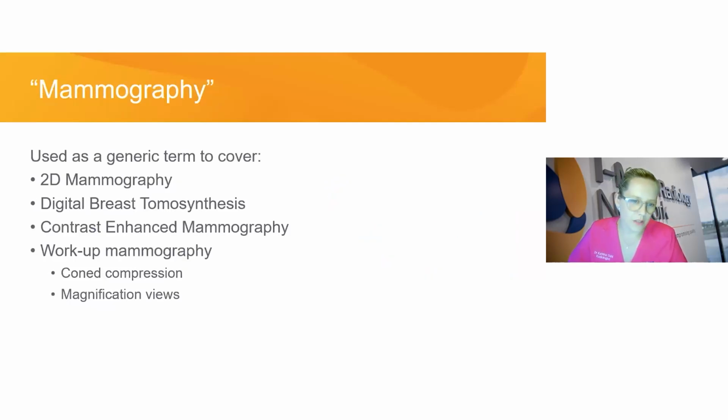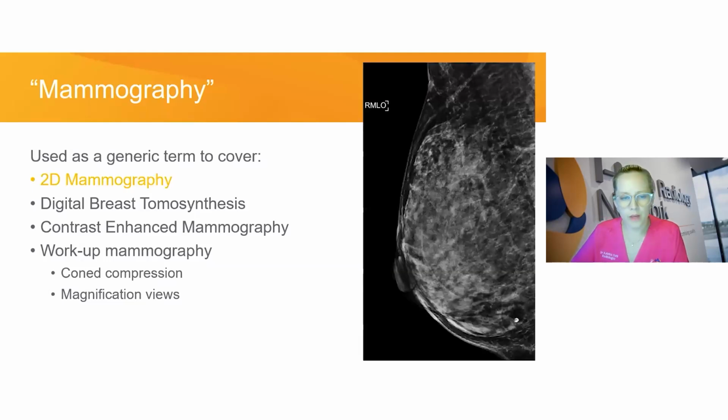So mammography is a very generic term now. It's done a full circle of being the only term we used, and now I use it to cover all the different types of mammography we're performing. So traditional 2D mammography started as film screen, it's digital now. This is what is performed with BreastScreen as a screening mammogram and forms a component in other examinations.